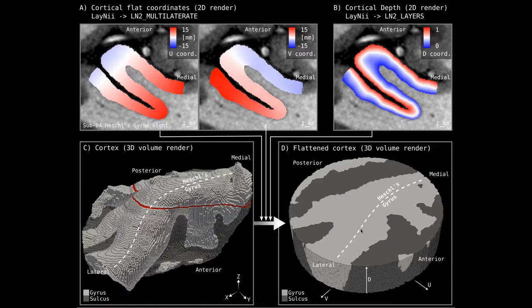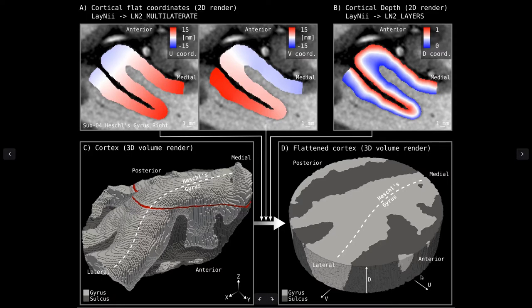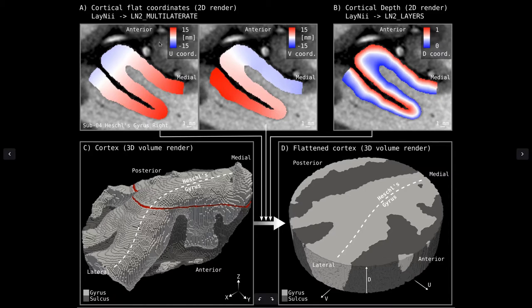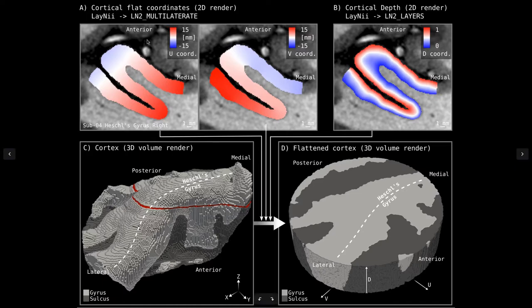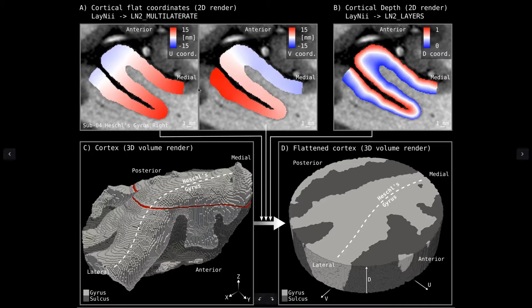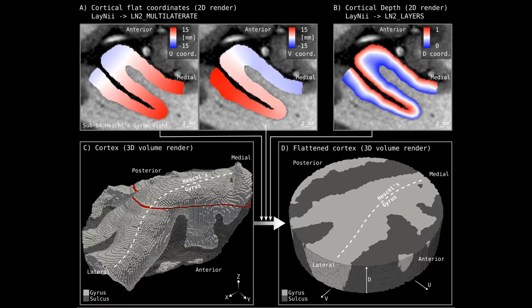However, here I am going to show you how to compute the other coordinates that are orthogonal to the cortical depth or cortical layers, which by getting inspired from the computer graphics field I called them U and V coordinates. Today I am going to talk about the other program I have implemented which is called Ln2 multilaterate. Multi stands for multiple and laterate stands for side. So this is basically a word I have made up to indicate that in this program we are figuring out the sides of the cortex not the depth. At the end of this program we will have two coordinates, the U coordinate and the V coordinate that are orthogonal to each other, and together they summarize the cortical surface that we have. When I say cortical surface I do not mean triangular meshes that are conventionally used in MRI data analysis, but just this geometric concept of the cortex being represented as a surface.